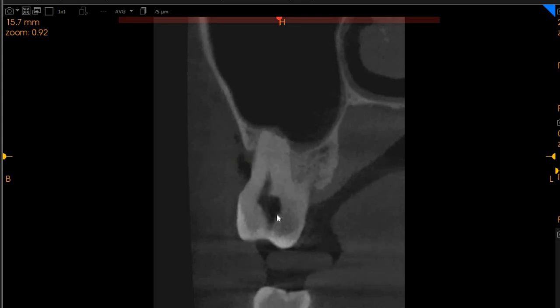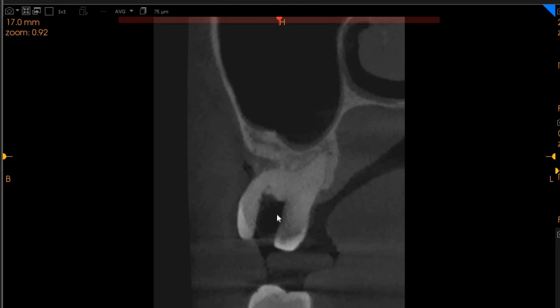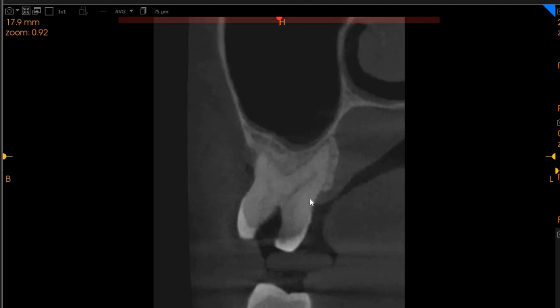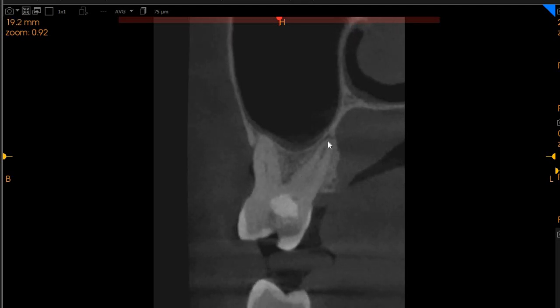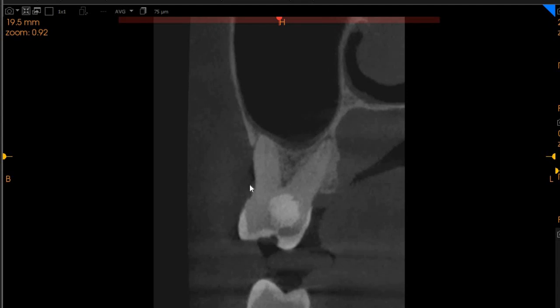Chamber opening has been done. This is the palatal canal, as you can see, all the way to the apex, and then we've got a restoration at the back.